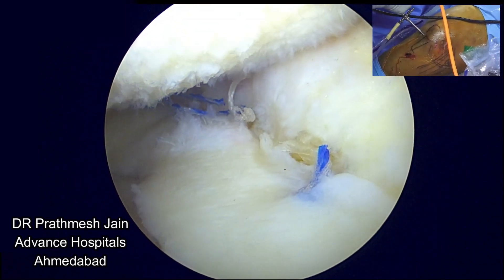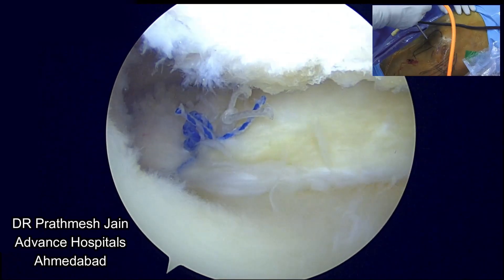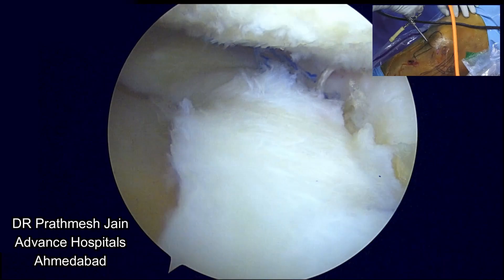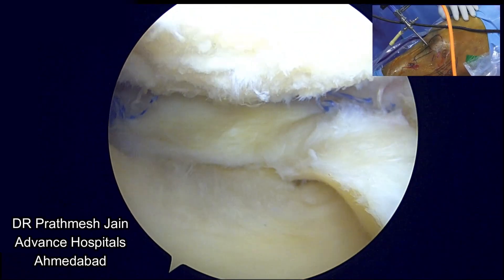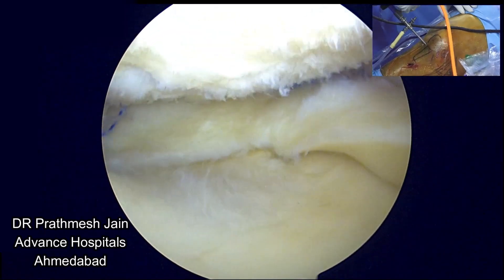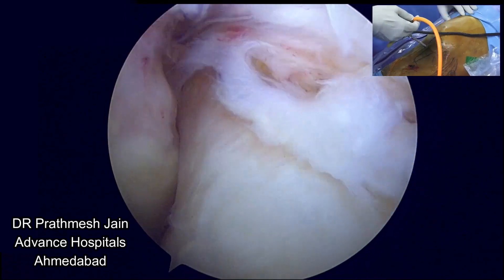This is the final picture: the anterior-most extrusion repair anchor, the body extrusion repair anchor, and the root fix anchor for the root repair — a very nice repair. Hopefully we can give this patient a good joint-replacement-free life for a long period of time. Thanks a lot for your patient hearing. Thank you.